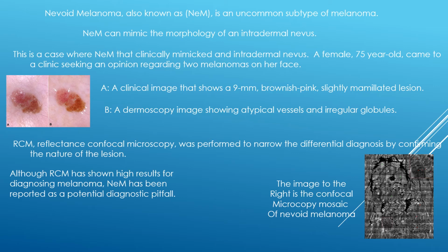Here is a case study on how nevoid melanoma, also known as NEM, is an uncommon subtype of melanoma. NEM can mimic the morphology of an intradermal nevus. This is a case of NEM that clinically mimicked an intradermal nevus.